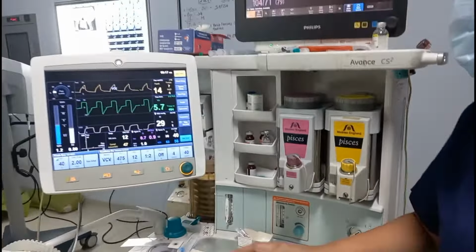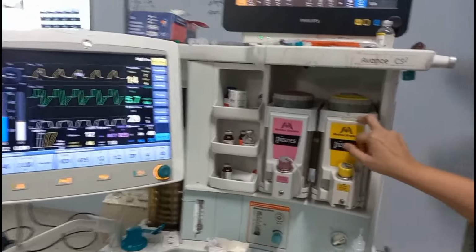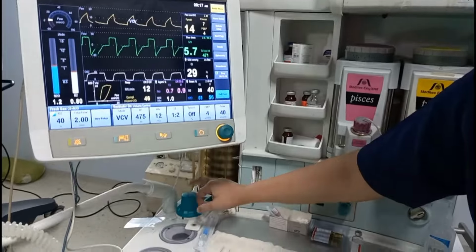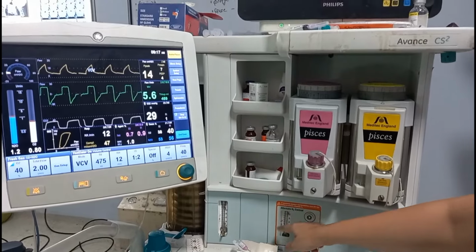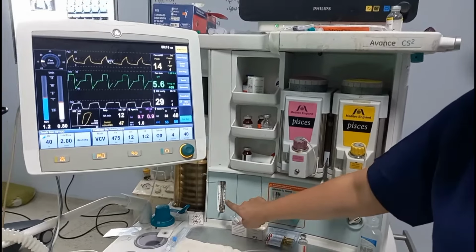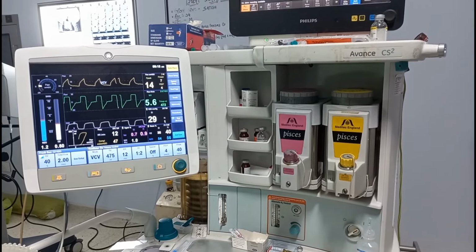As I had already told you, the flow control knobs are no longer here. This is the mounting system of the vaporizer which is a part of low pressure system. APL valve is there which is a part of low pressure system. And a common gas outlet is there which is again a part of low pressure system. There is also an auxiliary oxygen control, that if the oxygen is by chance not working, there is an auxiliary oxygen supply which can work for that much time.